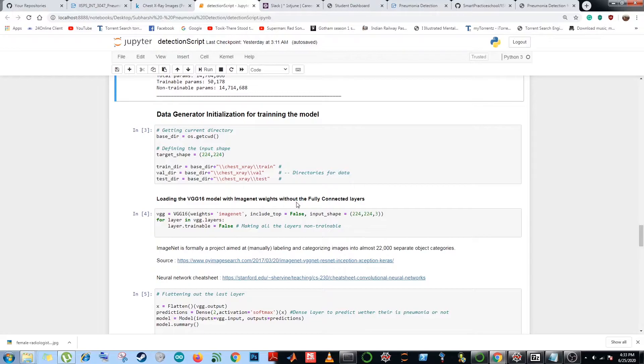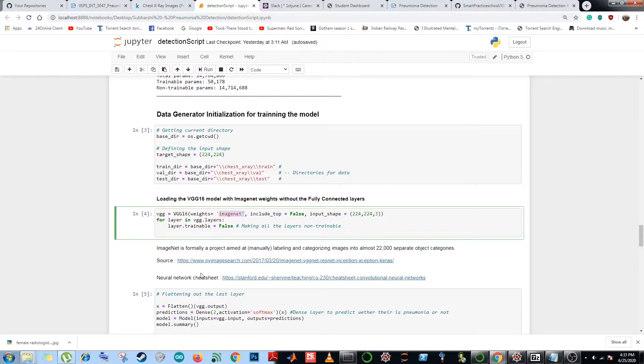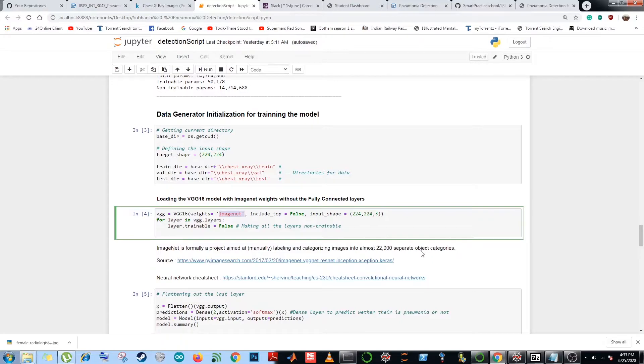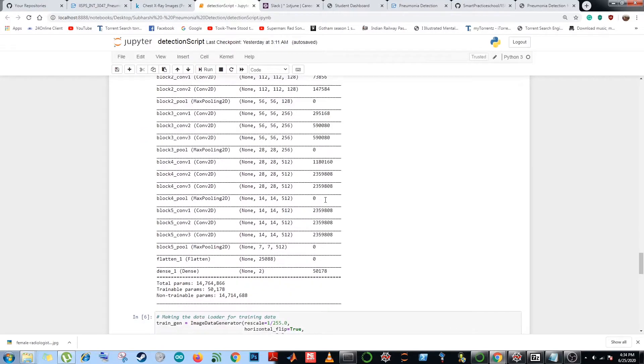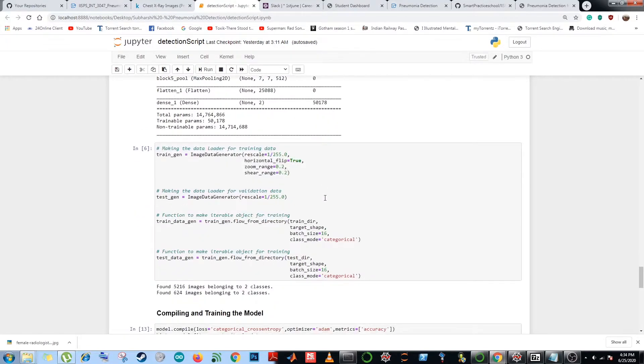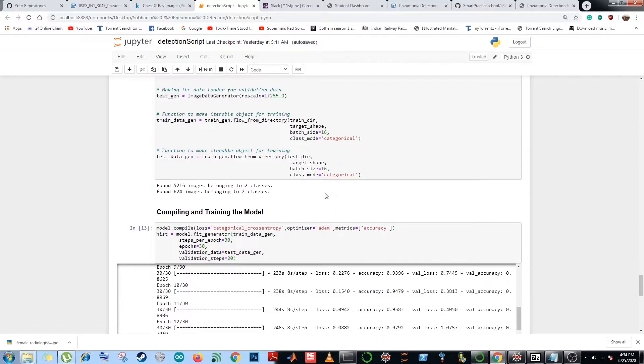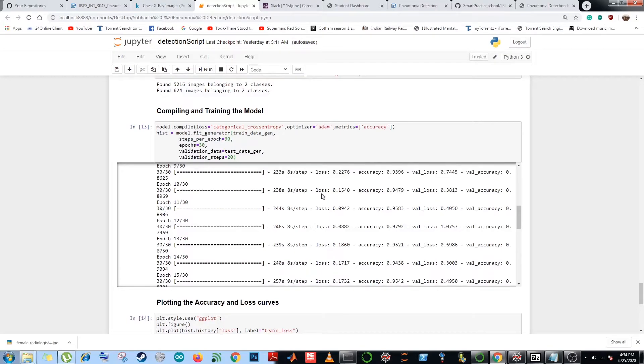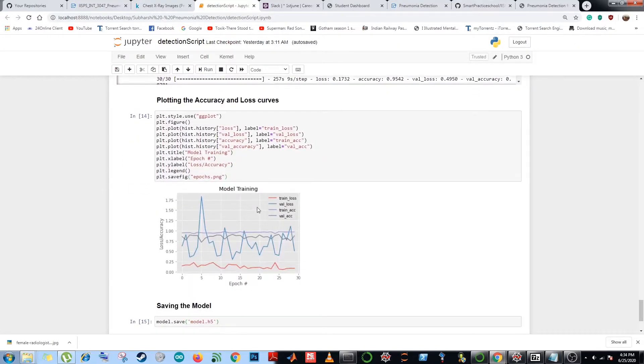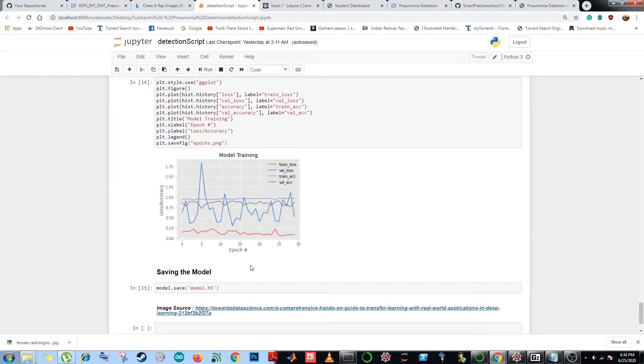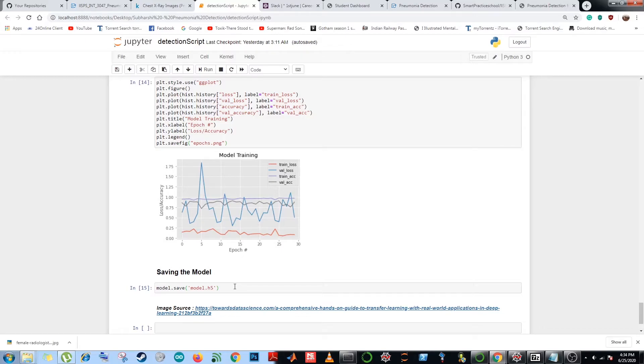We make a data generator for training the model. We load the VGG16 model with ImageNet weights without the fully connected layers. ImageNet is a project aimed at labeling and categorizing images into almost 22,000 separate object categories. Then finally, after flattening out the last layer, we compile and train the model, which approximately took me 45 minutes or maybe an hour to train. After plotting the accuracy and loss curves, as you can see over here, and finally saving the model with an h5 extension, which is hierarchical data format extension consisting of multi-dimensional arrays of scientific data.